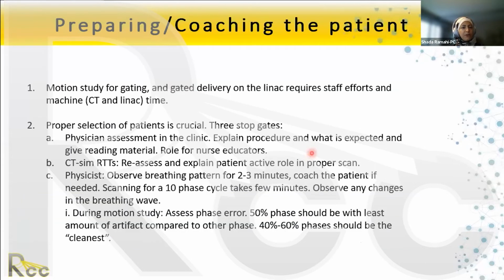First, you start with a good choice of patients. Patients have to be proper for gating. They need to be able to breathe in a cyclic manner. And you have to spend time on the CT simulation. You have to coach them before they go in.